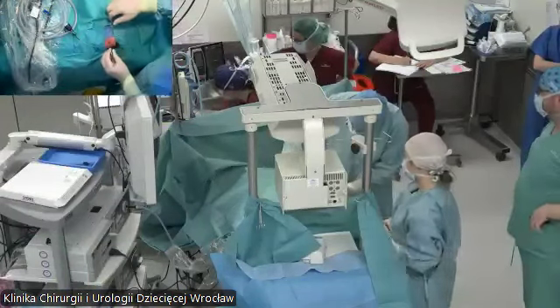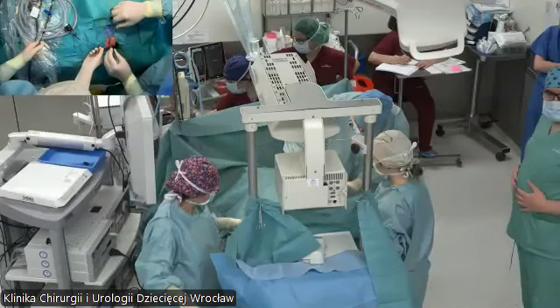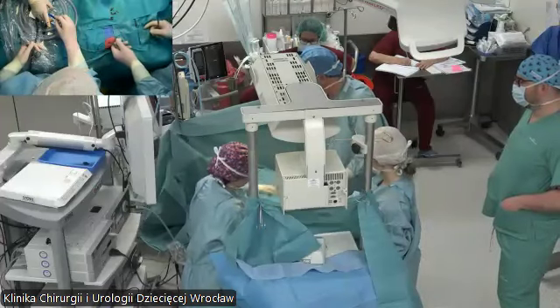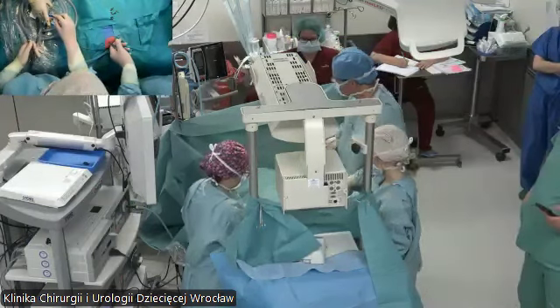Okay? Can we ask for the lungs to be expanded? Darek, a question for the anesthesiologist. Yes? What I want to ask your anesthesiologist is whether you changed any parameters when you did the pneumothorax. Did you change the parameters, doctor? Please speak into the microphone. The question was whether you changed any ventilation parameter when we started with insufflation.